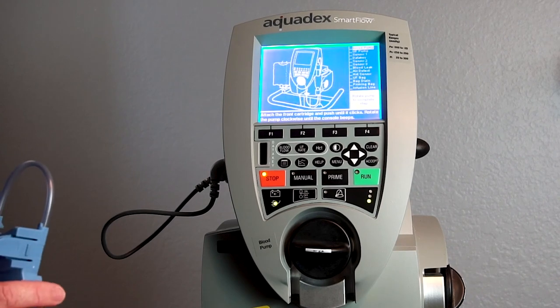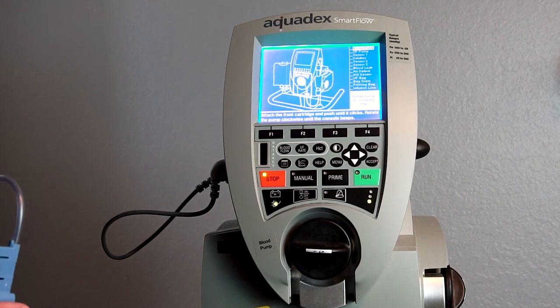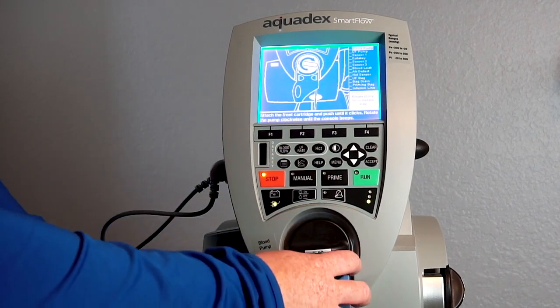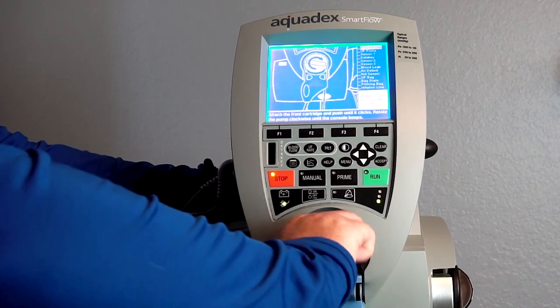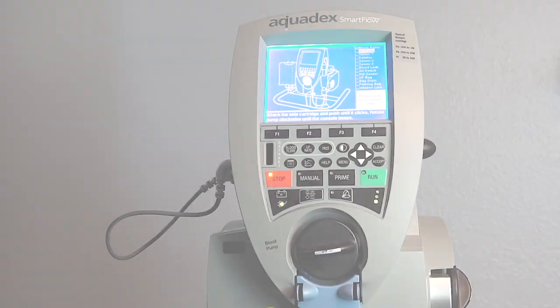A list of instructions appears on the screen. At this point, you'll want to open your blood circuit set. The first step is to load the blood pump cartridge on the front of the console. Use your fingers to guide the tubing and then push firmly between the prongs in order to click it into place. Rotate the pump clockwise until it beeps, and ensure that it's fully clicked.